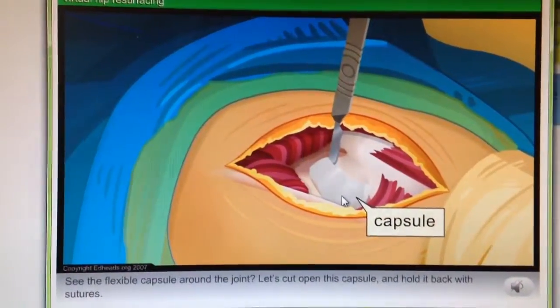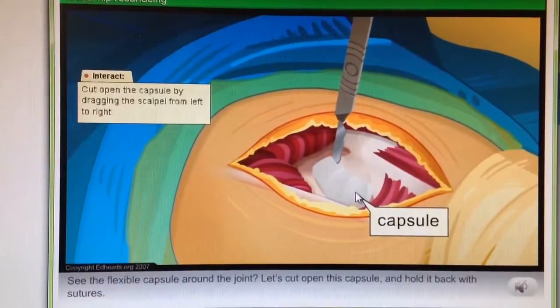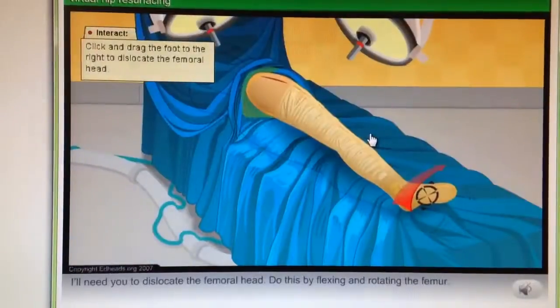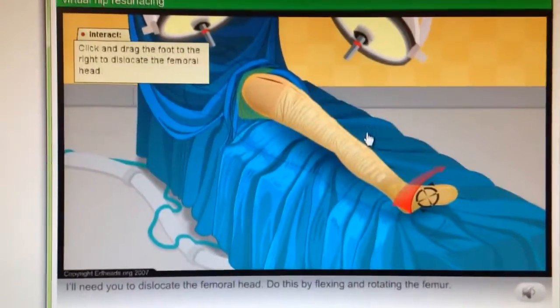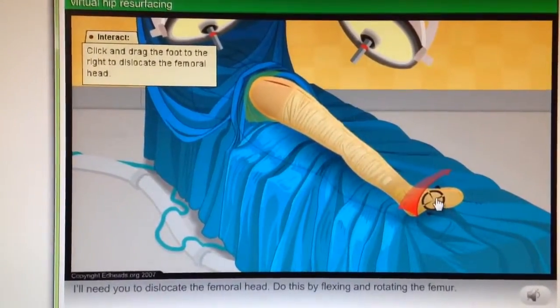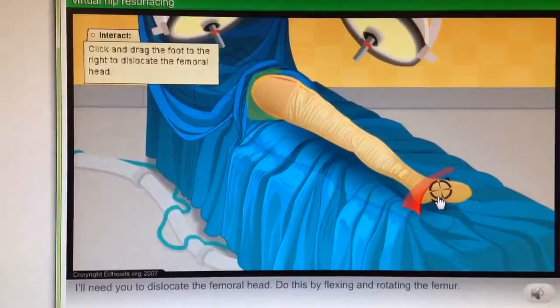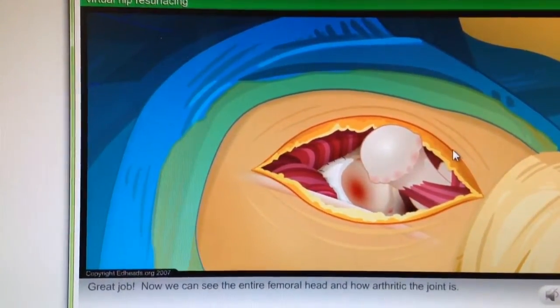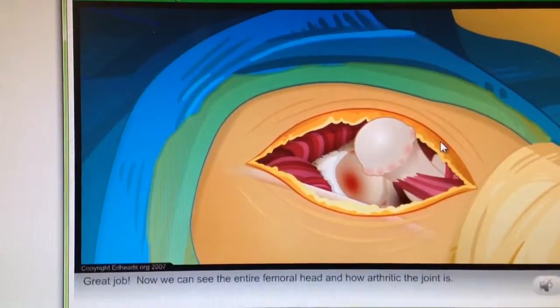See the flexible capsule around the joint? Let's cut open this capsule and hold it back with sutures. I'll need you to dislocate the femoral head — do this by flexing and rotating the femur. Great job. Now we can see the entire femoral head and how arthritic the joint is.